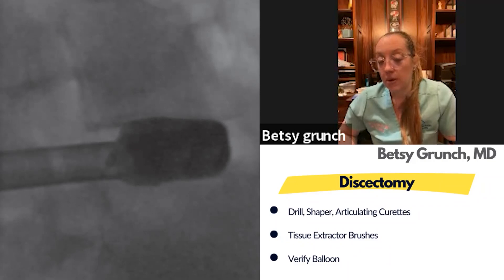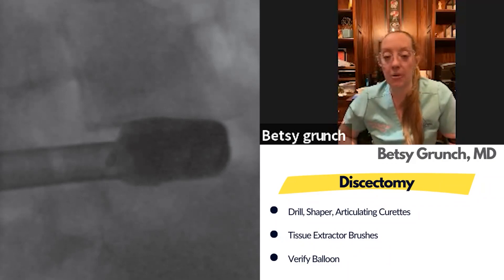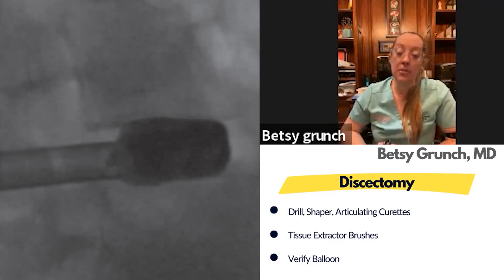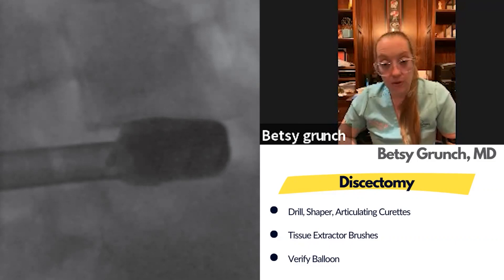If you've got a patient with not the best bone, you might even see a little violation on inflation — I wouldn't worry about that too much as long as it's just a small minute violation, because the implant will really shape to that size. What's great about this implant is that it fills all the three-dimensional crevices of the disc space more so than a triangular implant. I really don't see much subsidence with this implant — it just morphs into the end plates like an implant should.